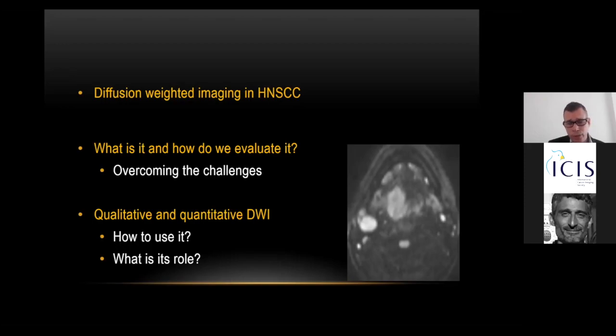So what I'd like to do is outline some of the technical challenges, and how we evaluate diffusion-weighted imaging in the head and neck. And the bulk of the talk will be about how we assess qualitatively and quantitatively diffusion-weighted imaging and try and determine what its role is.